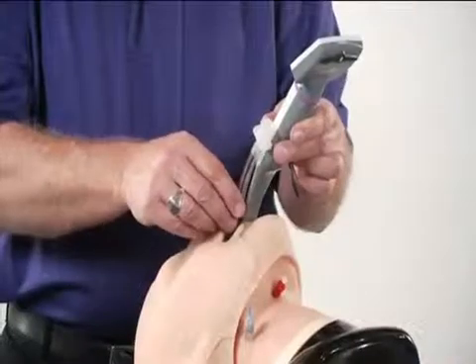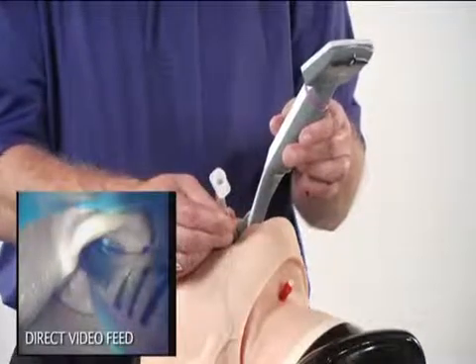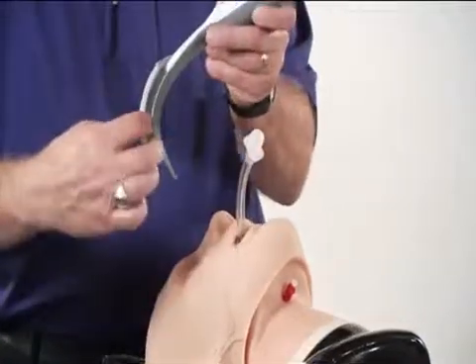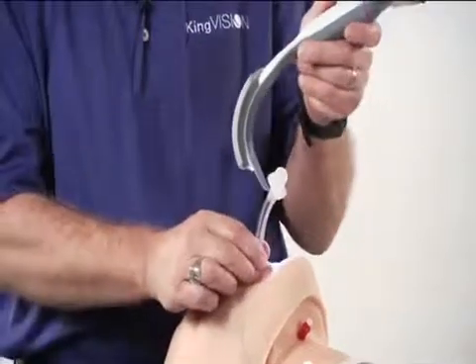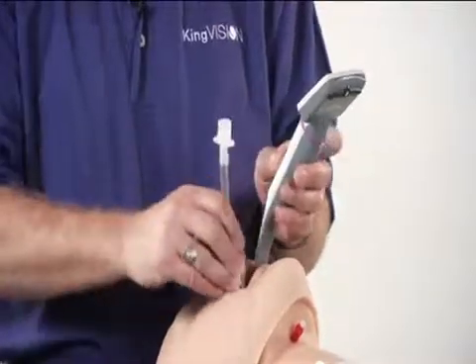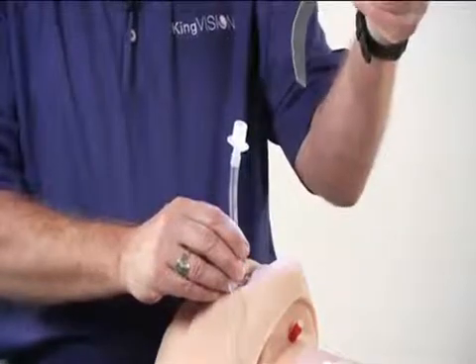To remove the tube from the channel, simply stabilize the tube off to the side to the right as you withdraw the blade from the mouth. And what happens is this soft, flexible overmold prevents any catching of the tube as you're separating it from the track. With the standard blade, it's important to remove the stylet entirely, make sure the tube is advanced appropriately into position, and then just simply remove the blade from the mouth.